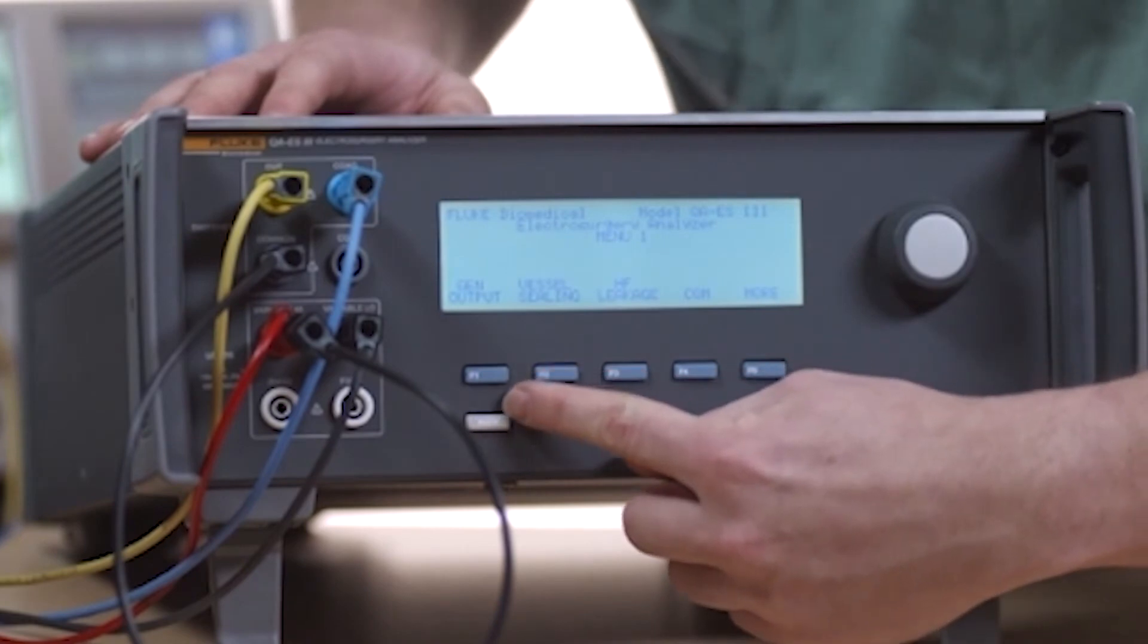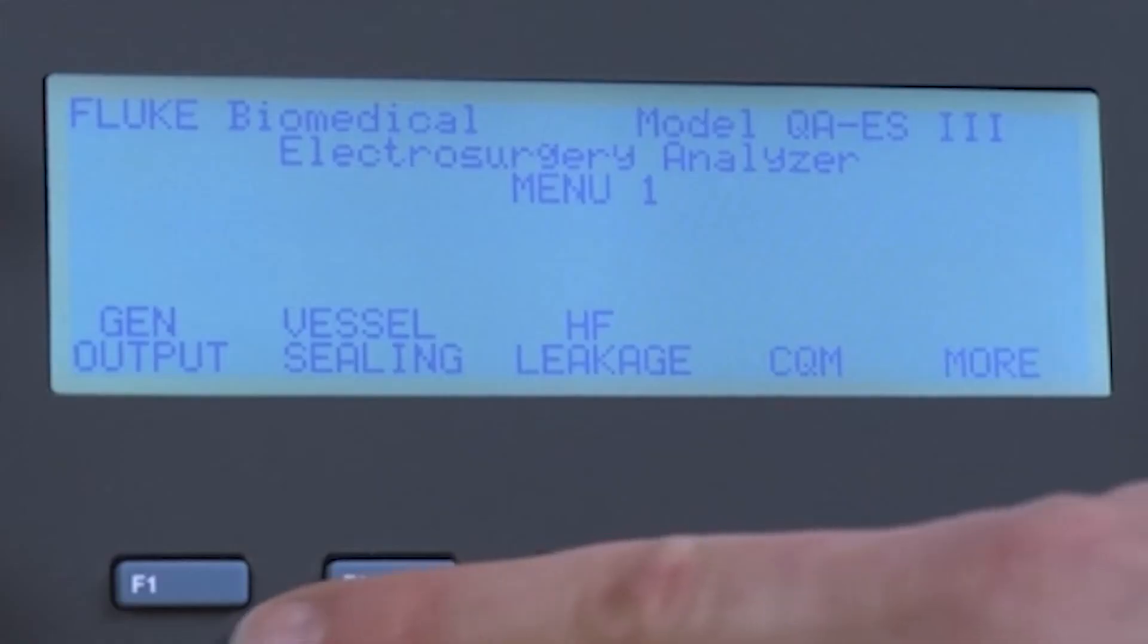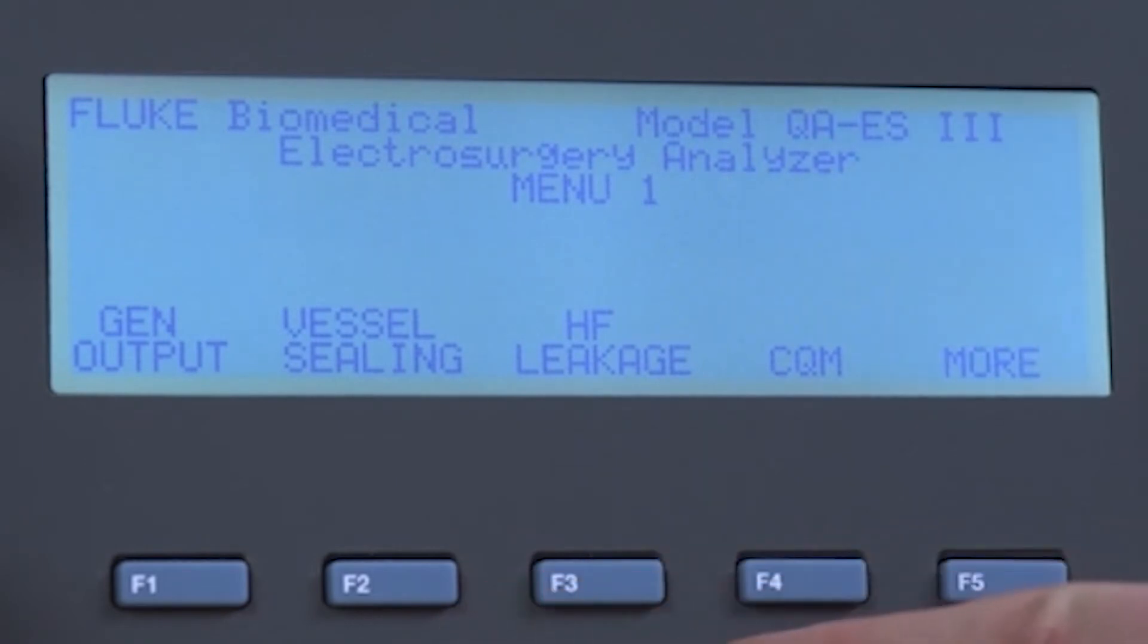Menu 1 allows you to select four different tests: generator output, vessel sealing, HF leakage, and contact quality monitor or CQM. The more button goes to menu 2.